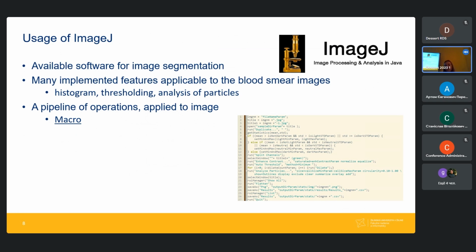And it's a very short code, I would say, that you can just save and maybe do some modification and apply to each and every image. So you don't have to do this repeatedly. You just have a bit of code and it works.